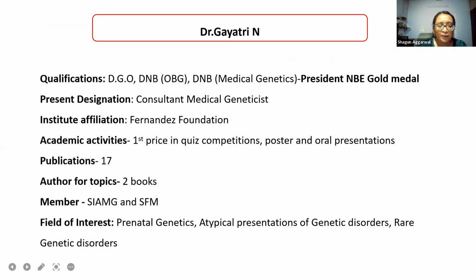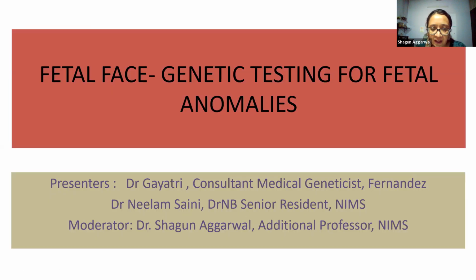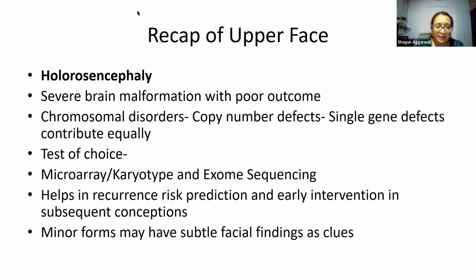Yes, so let's now move on. Last time, as Dr. Chinmay has mentioned, we discussed the upper face. We discussed when we have an abnormality in the upper face, how do we go about the workup? So we'll just do a very brief recap of that. Next slide. What we saw last time were basically three anomalies.